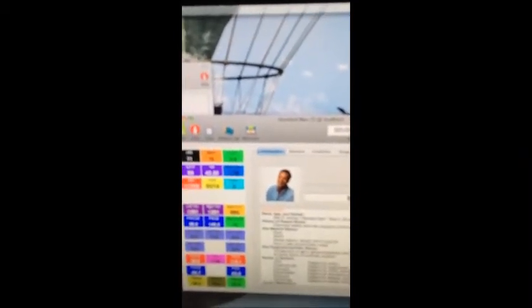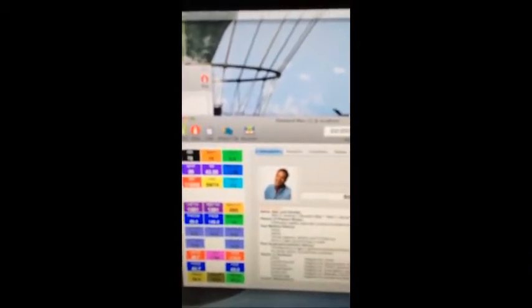So at this point, what often happens, we'll see if it does today, when the mannequin first connects, especially if he's been off for a long period of time or if the gases have just come on, his respirations usually start out at 0. That's not happening right now because he's been on earlier today. Anyway, don't worry about that. Very often his resps start at 0 and he's not blinking for the first minute or two.